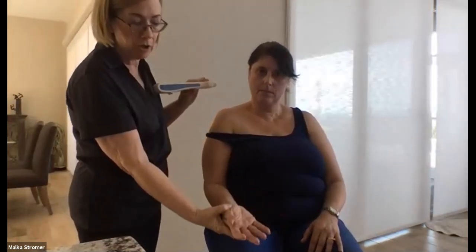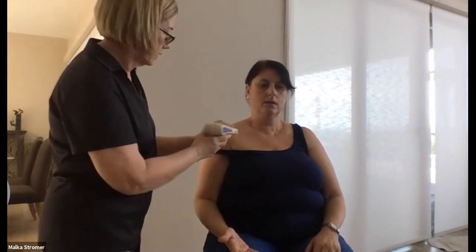So I'm going to put her palm up. The reason the palm is up is that if the palm is down, your elbow tends to go out, and we want to keep this as close to the body as possible. You can palpate where the bicipital groove is, and I'm going to go directly over it here. So I am in a short axis view through here. I'm going to scan down to about the pec major attachment off the biceps, come back up, and then rotate this 90 degrees.